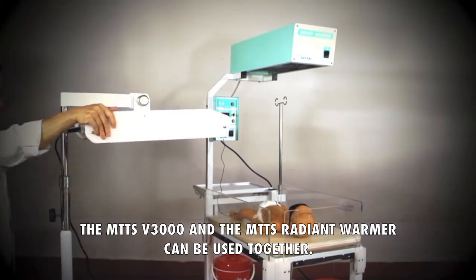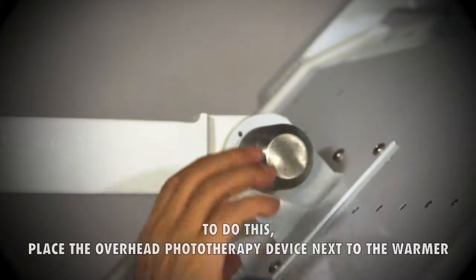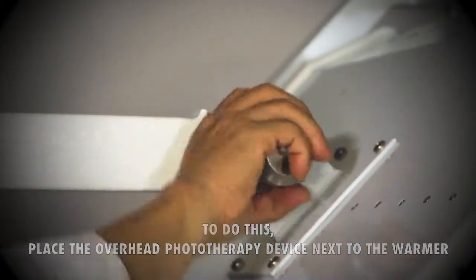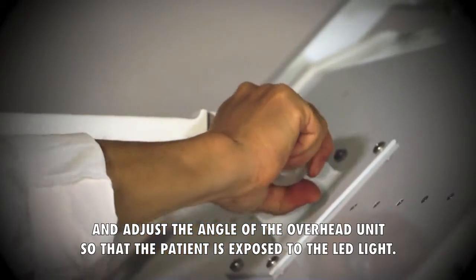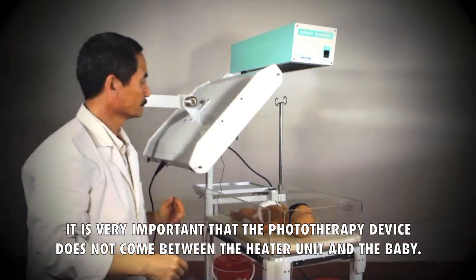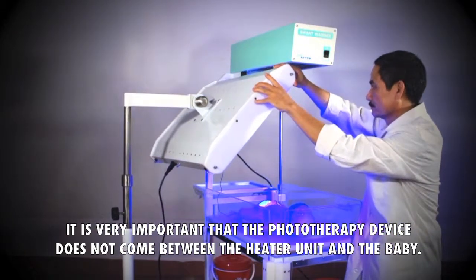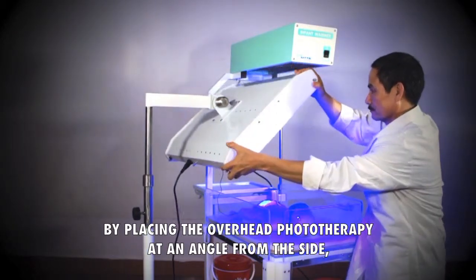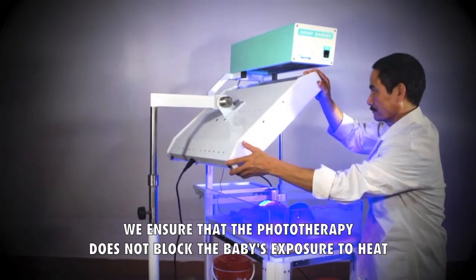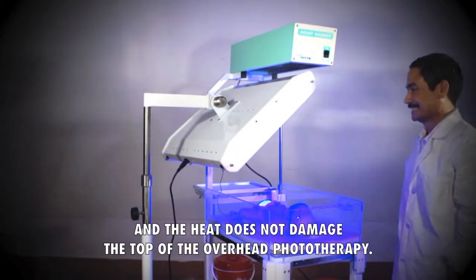The MTTS V3000 and the MTTS Radian Warmer can be used together. To do this, place the overhead phototherapy device next to the warmer and adjust the angle of the overhead unit so that the patient is exposed to the LED light. It is very important that the phototherapy device does not come between the heater unit and the baby. By placing the overhead phototherapy at an angle from the side, we ensure that the phototherapy does not block the baby's exposure to heat and the heat does not damage the top of the overhead phototherapy.